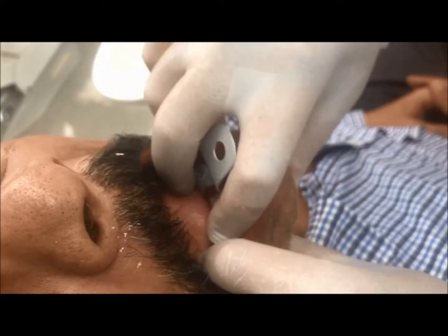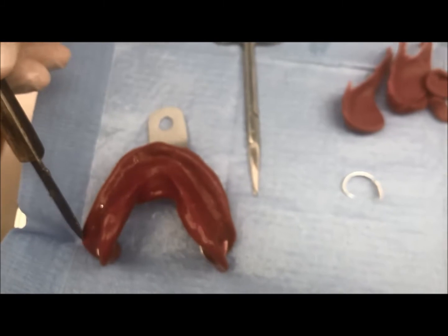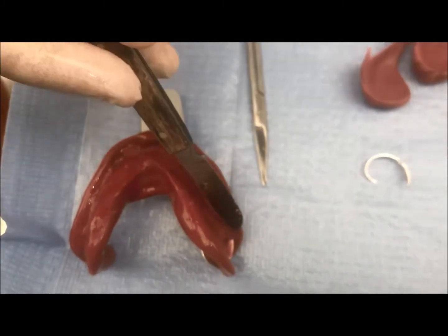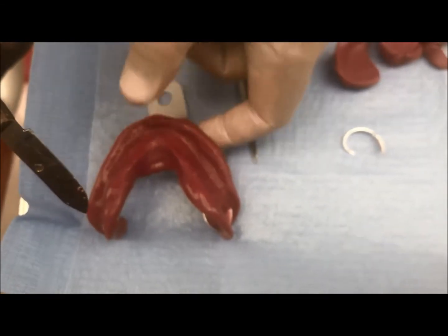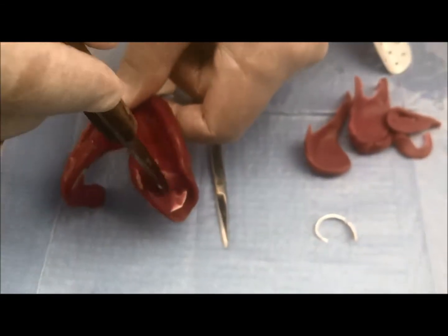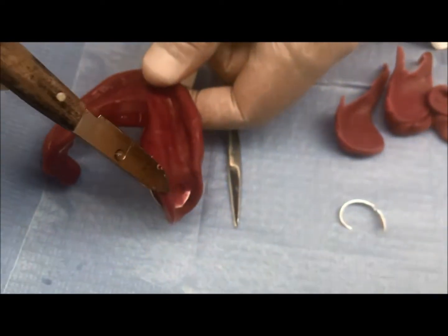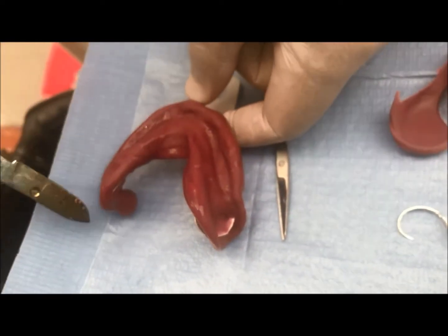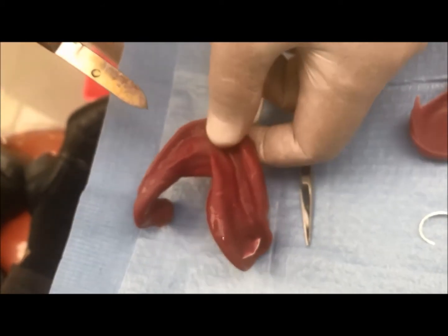I wait until the material hardens, then I remove the impression. Looking at the impression, the borders at the buccal and labial parts are smooth and rounded — no metal is showing from the tray. At the lingual side, the retromolar pad is recorded on both sides, and the lingual pouch with its S-shape is recorded on both sides. Thus, this is an ideal impression.